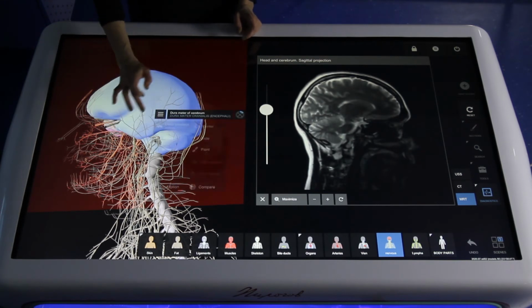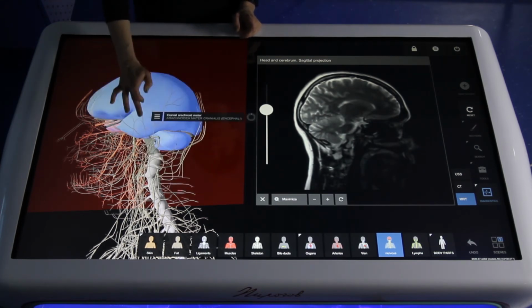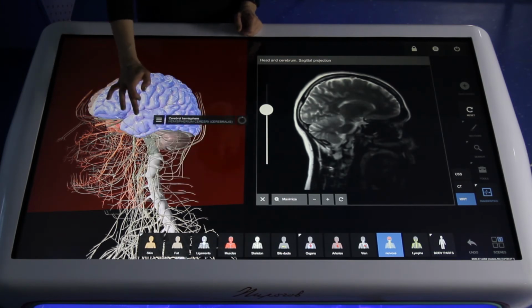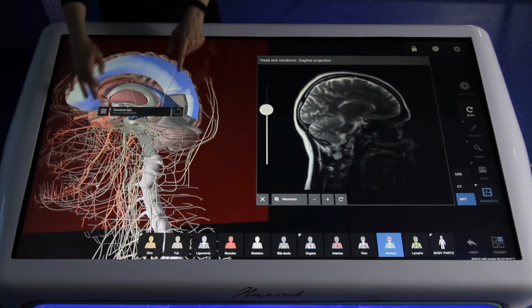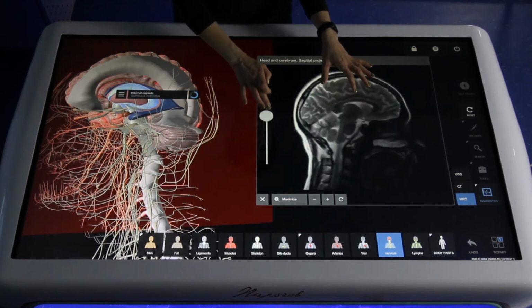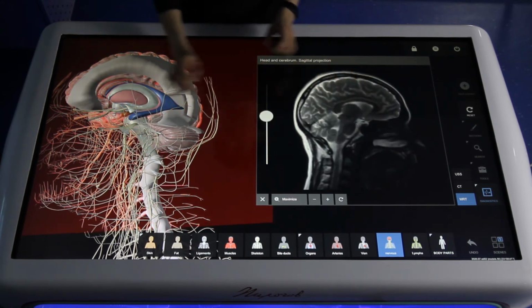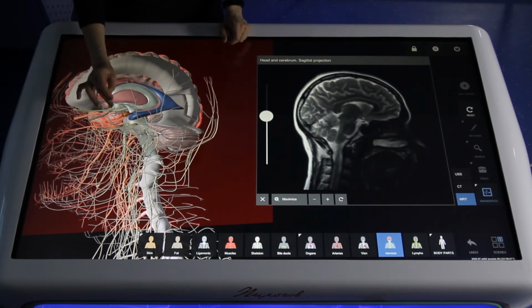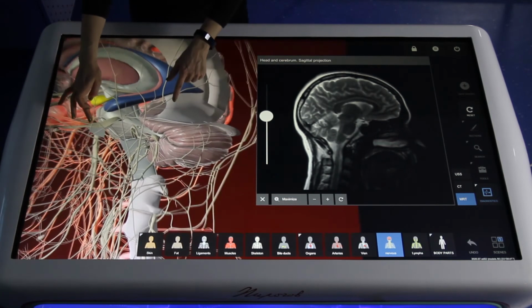And I can show you how it works with the tools. I can delete it one by one, step by step. And it means that I can show students the internal structure, how it compares with diagnostic data. It's more clear, it's really a good way to compare it. And if you would like to draw students' attention to some small details, you can paint it, that it works.